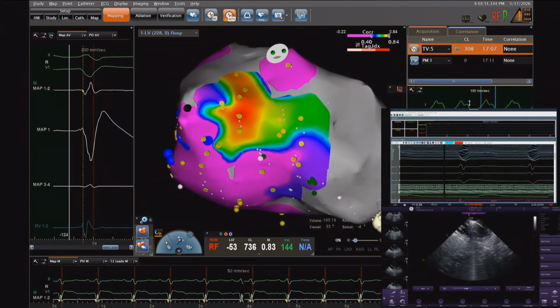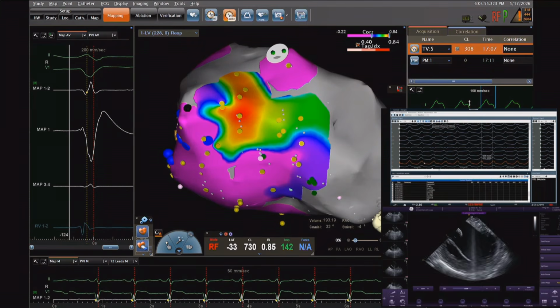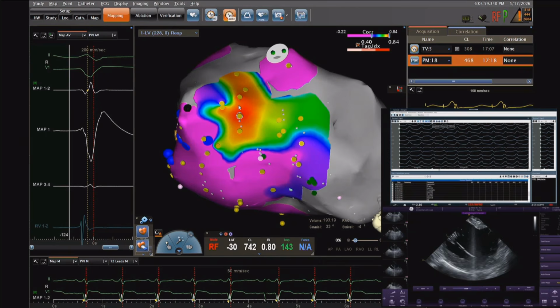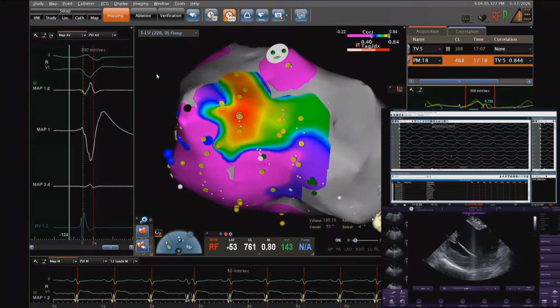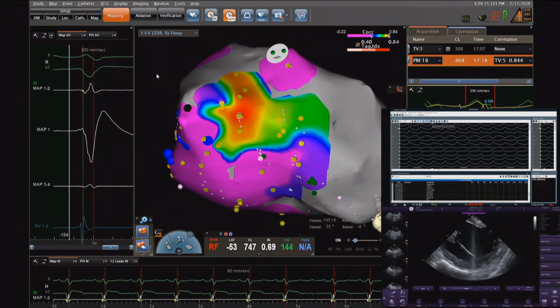Can we see also VT instead of ICE? We give there VT during this VT, the screen. Okay. Can you see the ECG? Can you switch out the ICE image and put there this static screen? Okay, now we see it.